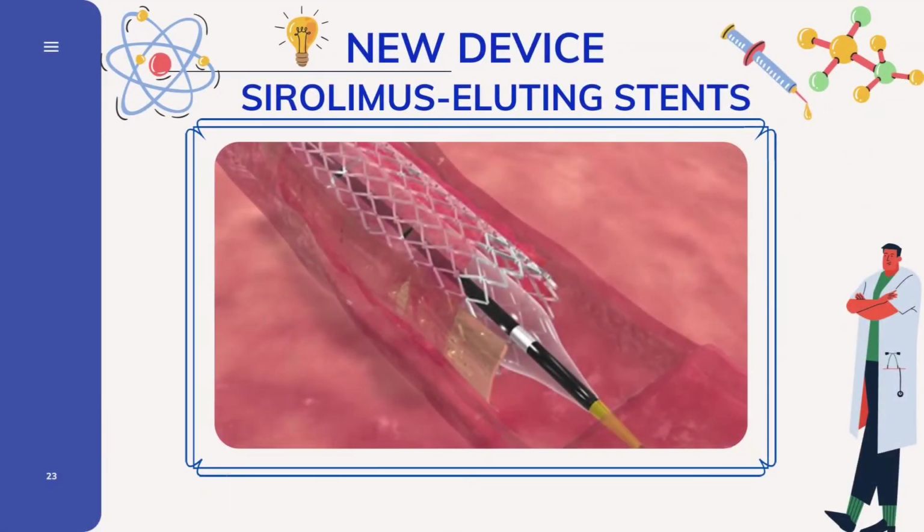It took great courage around 30 years ago to tackle stenotic lesions within a diseased coronary artery using the percutaneous approach in an anesthetized human being. Since then, unbelievable progress and research have been taking place worldwide in a continuum that never seems to end. Percutaneous coronary intervention, or PCI, is for the responsible interventional cardiologist not only an appealing method of coronary revascularization, but also a permanent challenge, as the technical progress must be balanced against the perceived foreseeable risk to the patient.